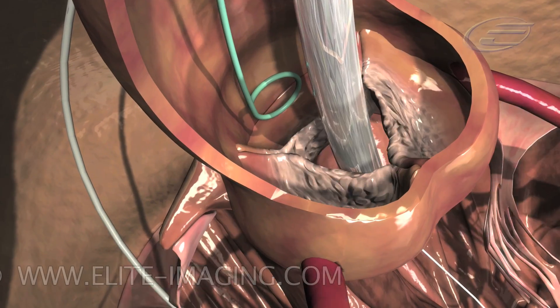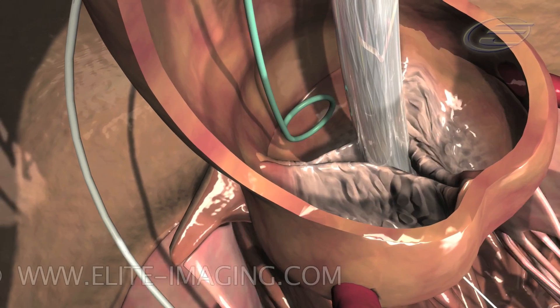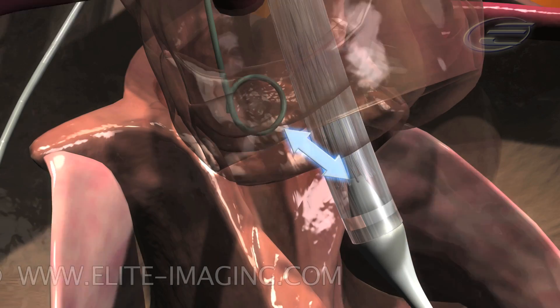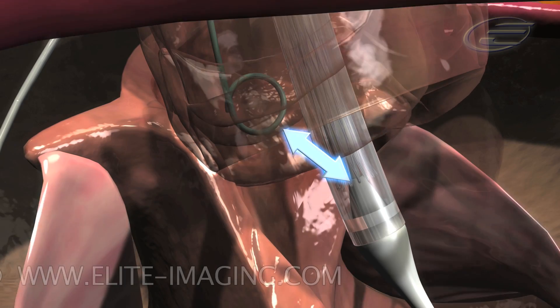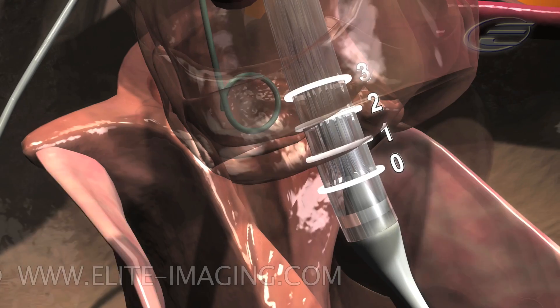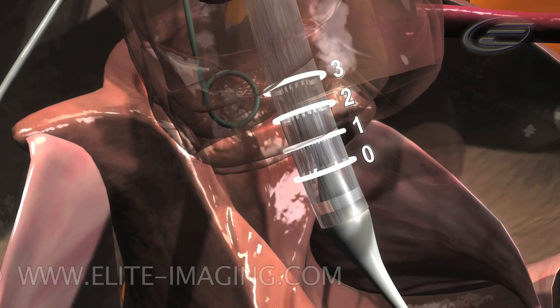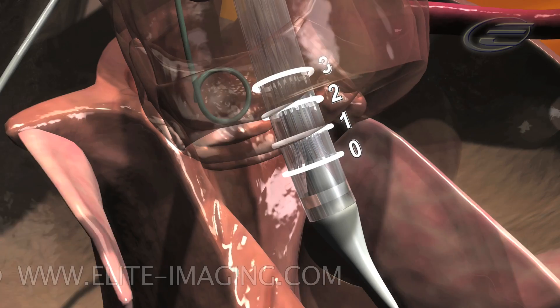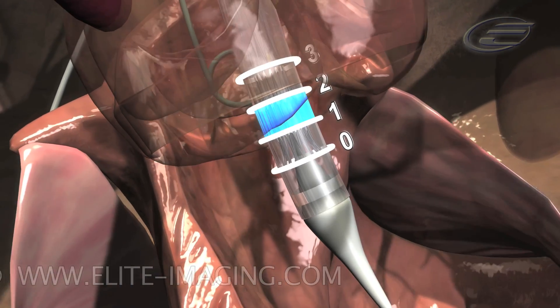Perform an angiogram. Confirm that the pigtail catheter is still within the non-coronary cusp of the aortic root. Visually identify the distance between the base of the aortic root and the inflow edge of the valve frame. Note the radiopaque contact points — counting from the inflow edge of the frame, optimal placement of the valve is the shaded area between the first and second contact point implanted within the aortic annulus.